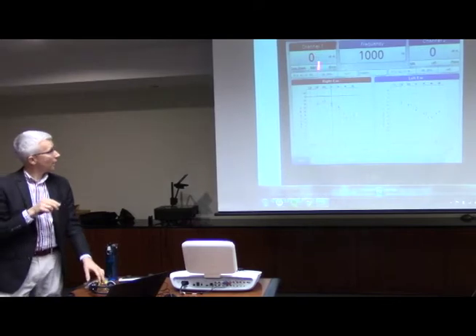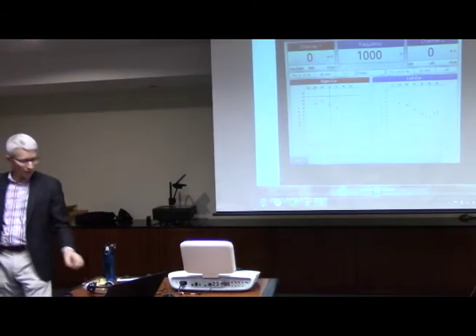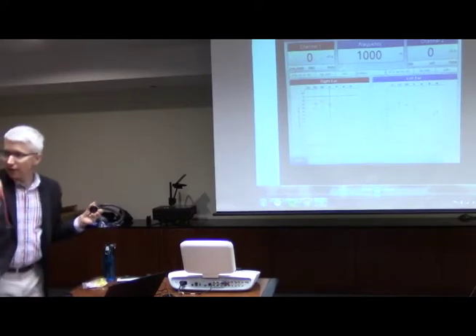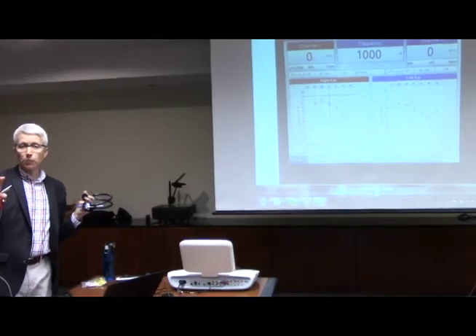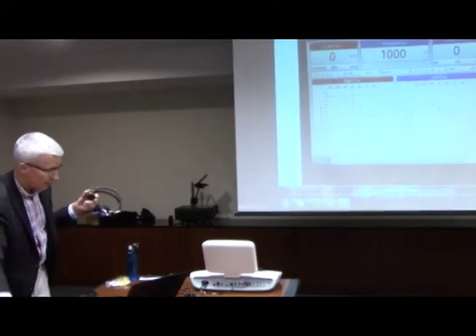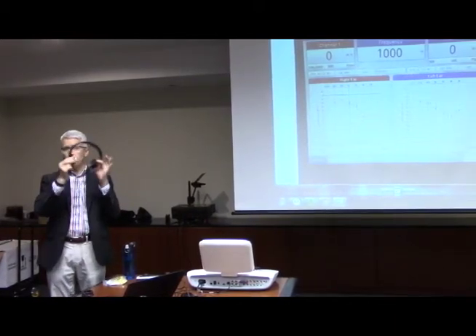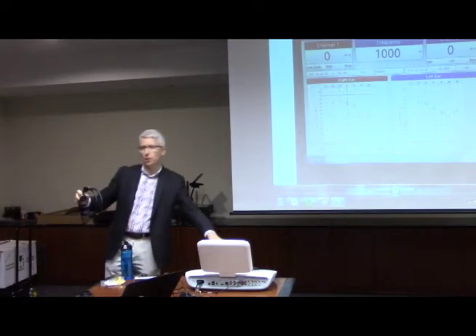Basically, I want to make sure whatever that says there, so let's say I've got it set to 40 decibels, 50 decibels, I want to make sure that what is coming out of here, or what is coming out of here, is that exact level. So that's what calibration is. We're sort of calibrating the equipment, but really what we're calibrating are the transducers, what transmit the sound out. We're calibrating the transducers to the equipment.